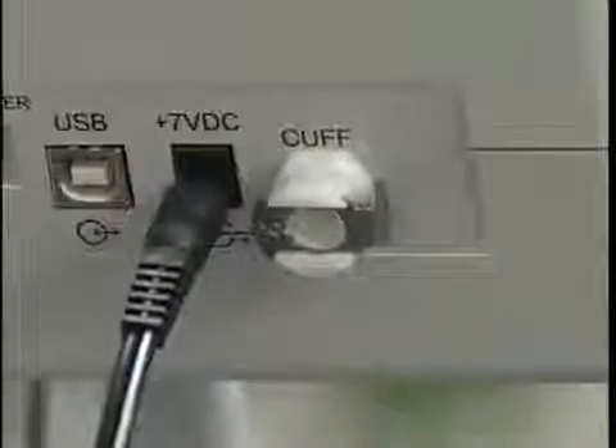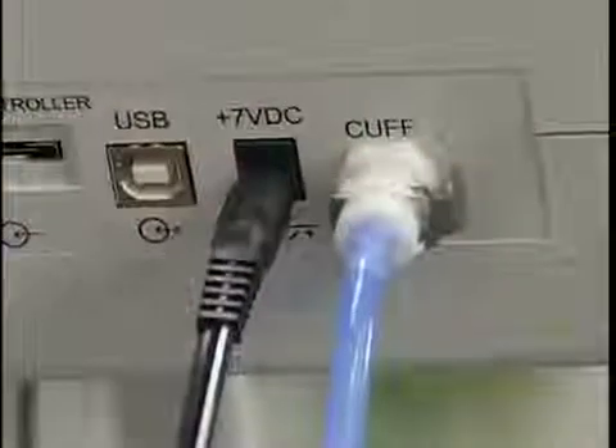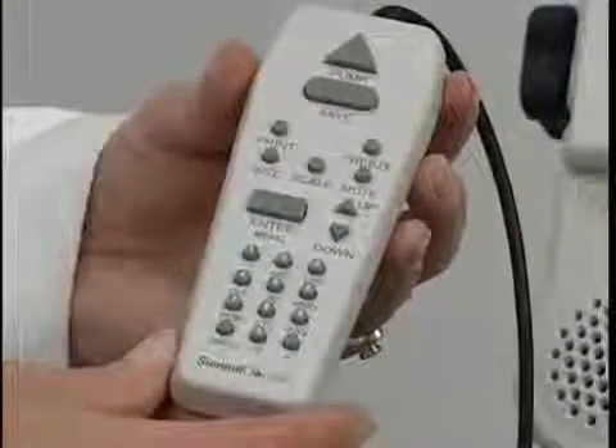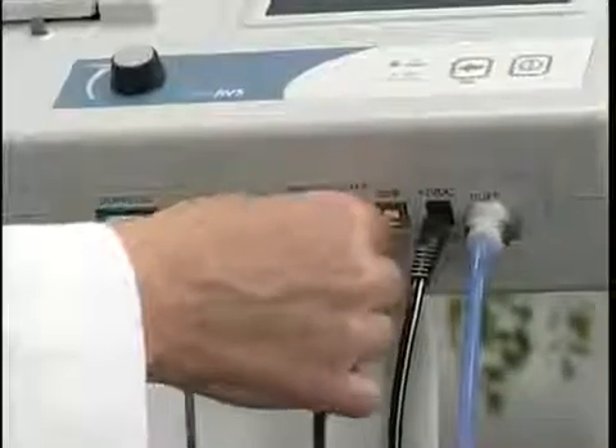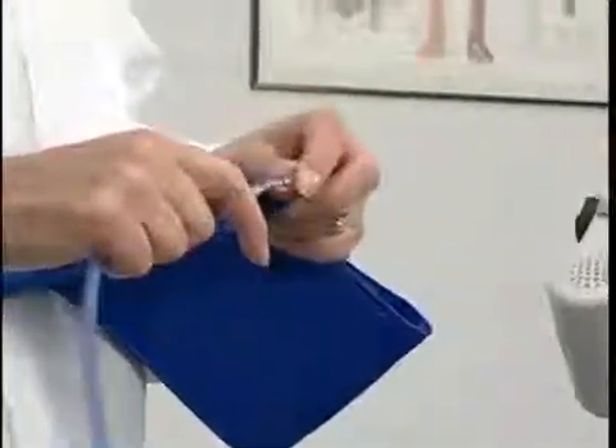Plug the hose quick connect style fitting into the cuff connector. The Vista AVS is managed using the handheld controller — plug it into the hand controller connector. Next, attach the lure style hose fitting to a cuff.